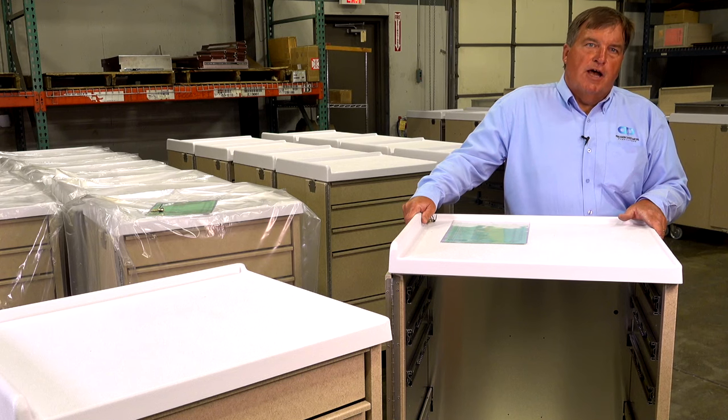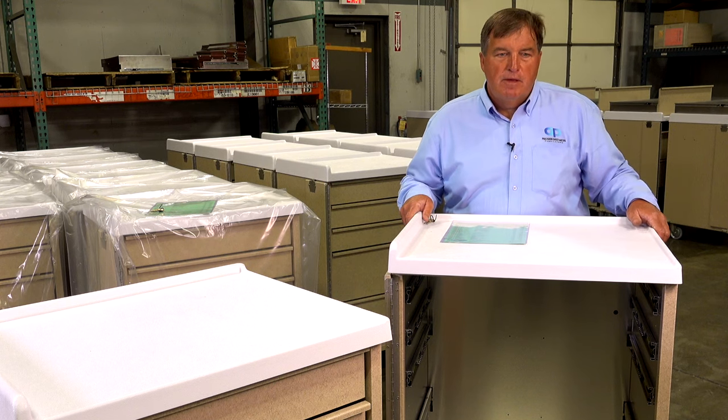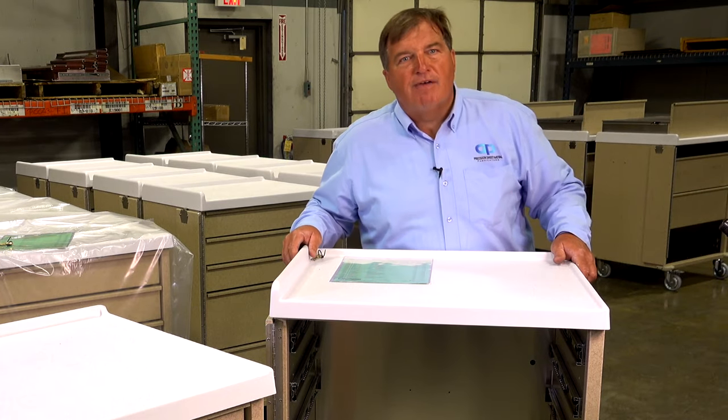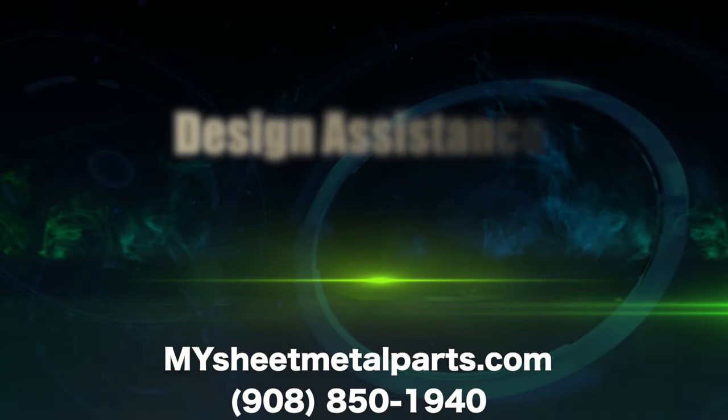When we originally took over the design of this cart, it was made out of an aluminum square tubing frame, and we redesigned it into a sheet metal Poprovita construction. And that's one of the reasons we have a happy customer, and every year they keep on ordering more.